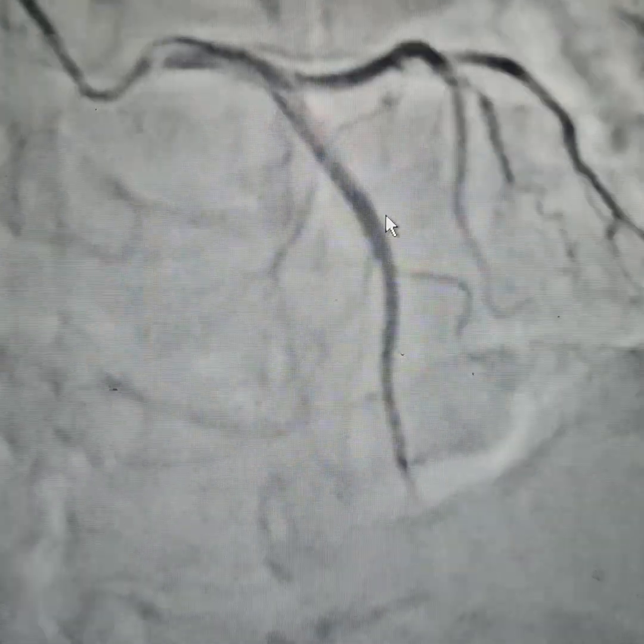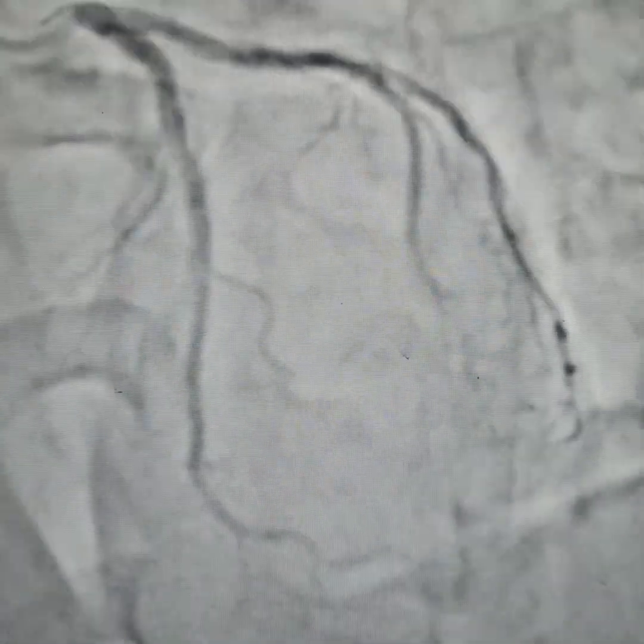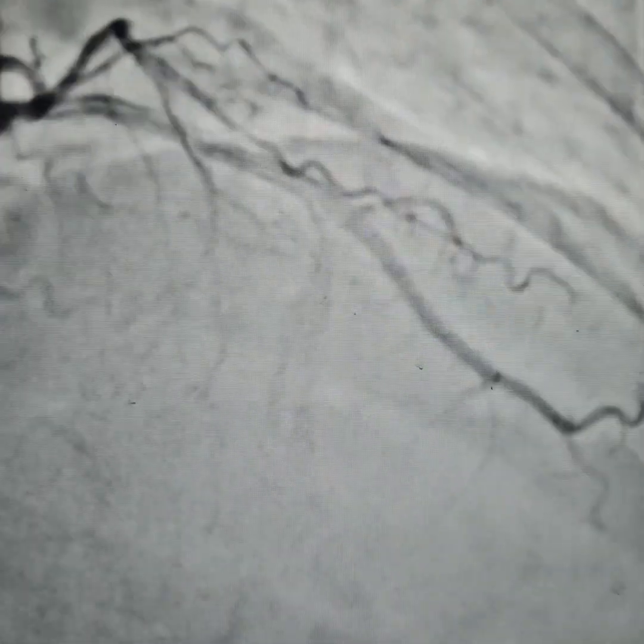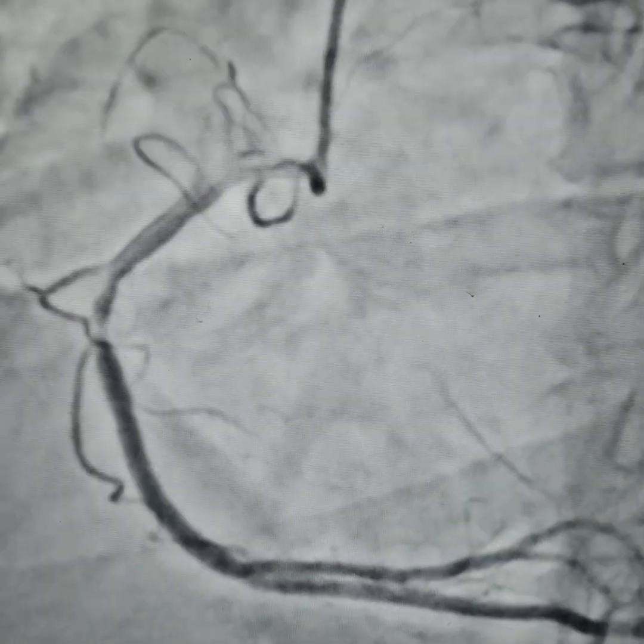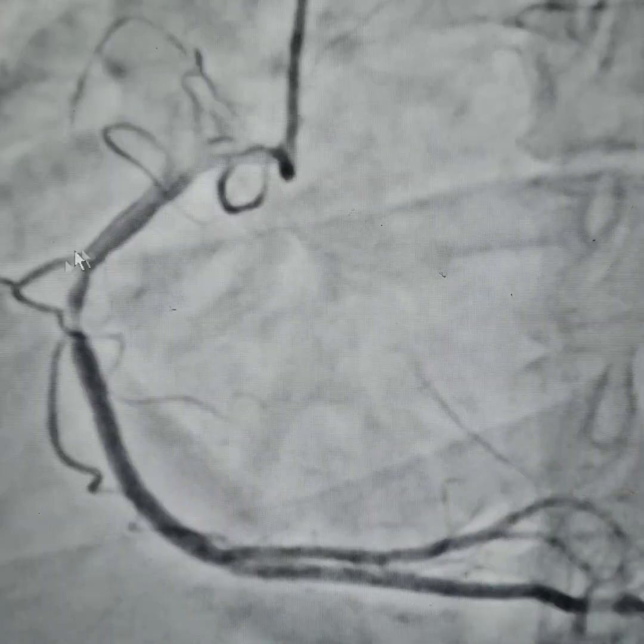We've kept the LDL under control, and this is just a perfectly placed stent even after 4.5 years. But the problem is, after 4.5 years the patient has developed a lesion in the mid RCA that is causing her problems.